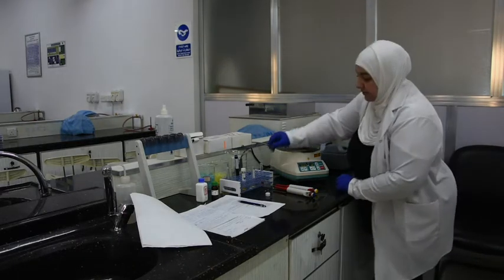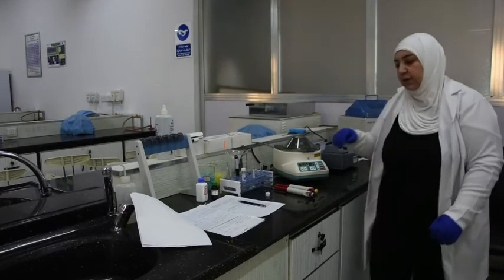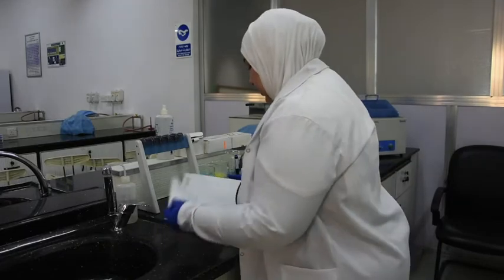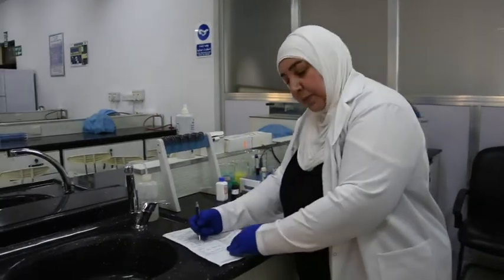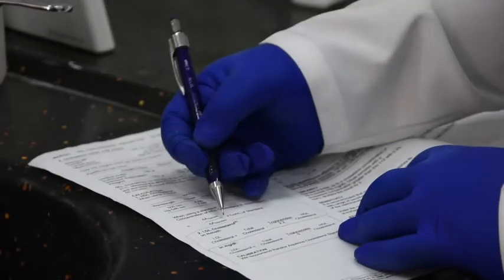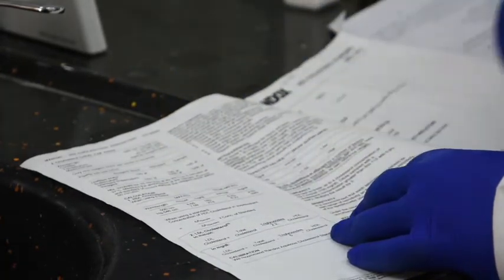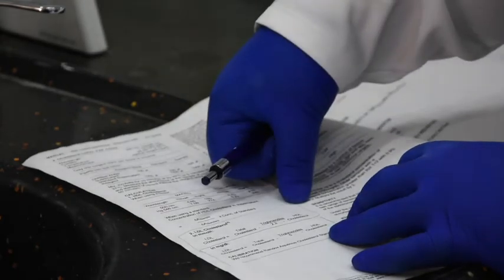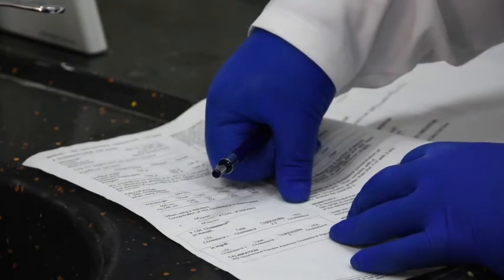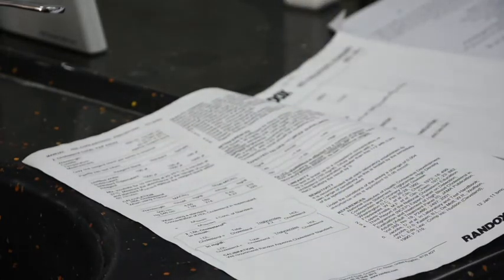Then we take it and read at 500 nanometer to see the result, 0.06. We need the leaflet to calculate. The absorbance of the sample is 0.06, and the absorbance of the standard is 0.02. We take the concentration of the standard from this. Then we get the concentration of HDL cholesterol in the serum.